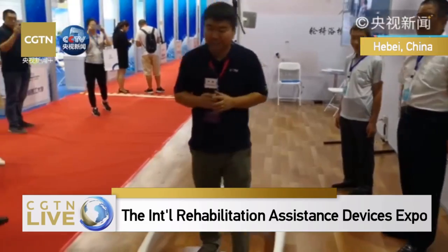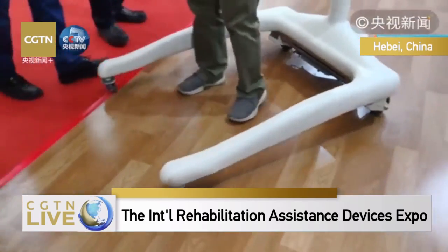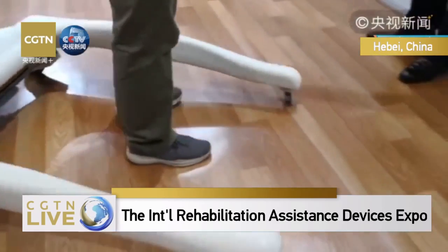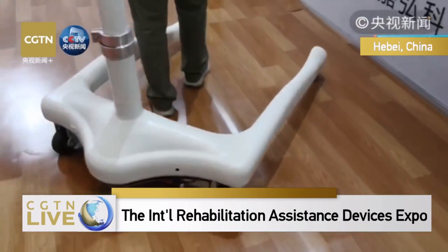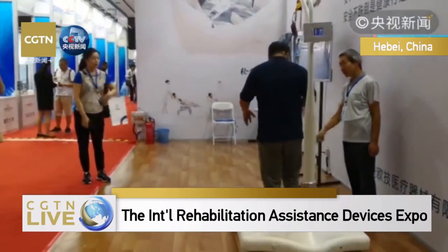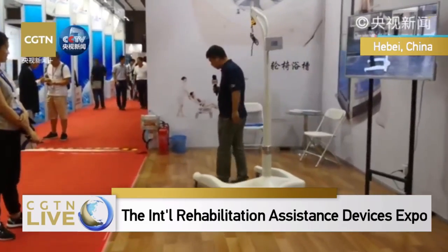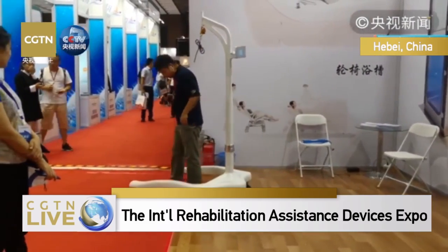You can have a try. You can relax. I can turn right and turn left. I think I shouldn't be walking too fast, right? The shelf is following me constantly.